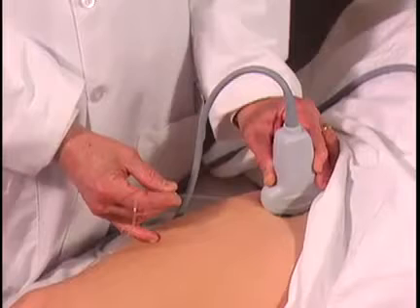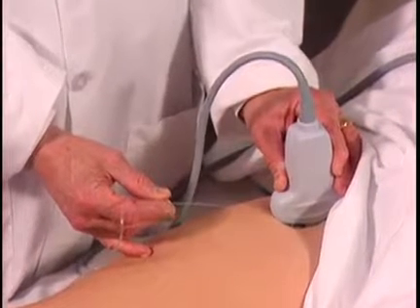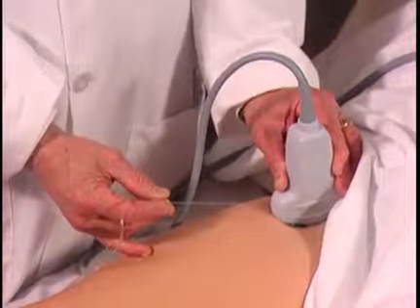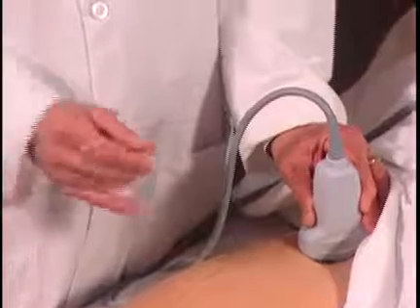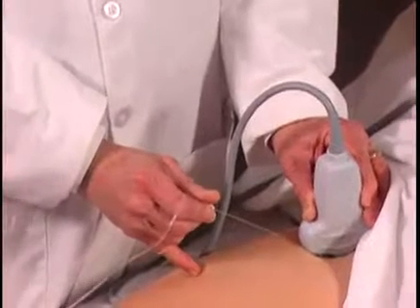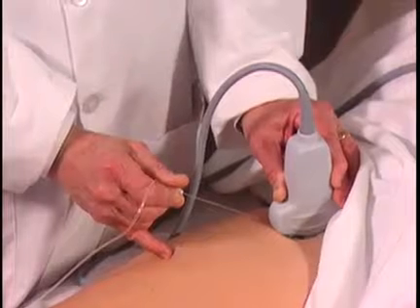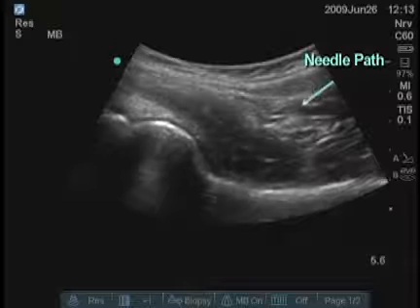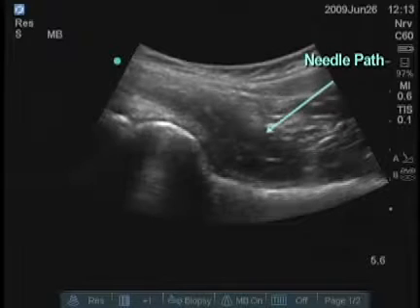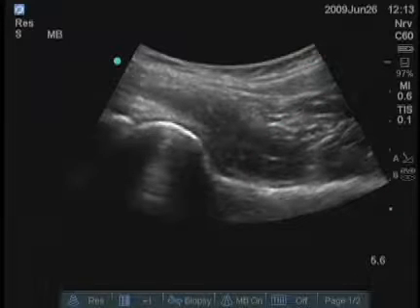What I would do is mark with an indelible pen close to the transducer, cleanse this area, anesthetize it, and insert the needle at approximately this angle, parallel to the transducer, so that the needle is as visible as possible. You can check the angle of the needle quite quickly once you see the needle coming in on the right top of the screen, and adjust the angle and depth accordingly.